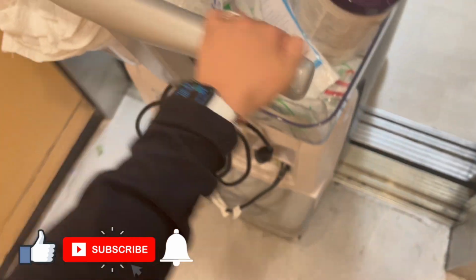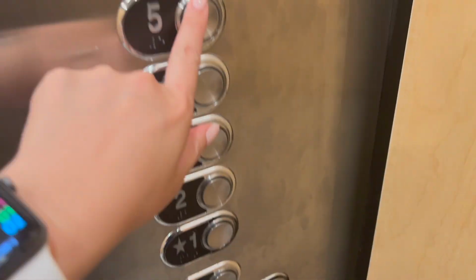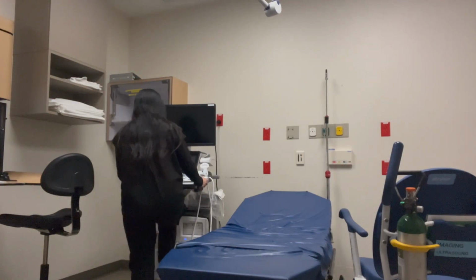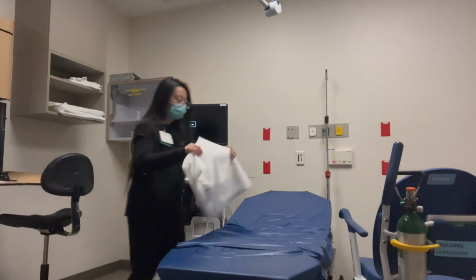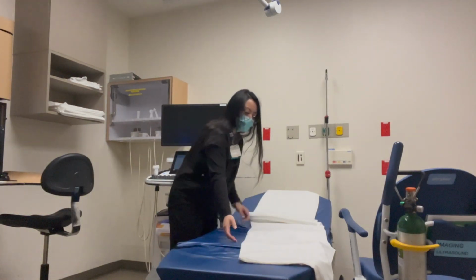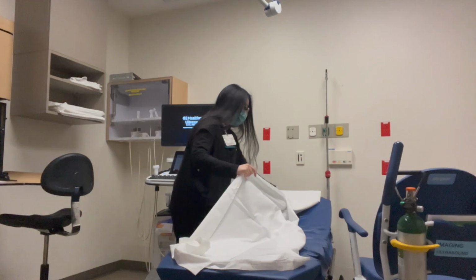Today I work a 10-hour shift, and because I work in a hospital, there are many different types of patients that need to be done. Inpatients are where the patients are admitted in the hospital and they're staying overnight. Outpatient is where the patient is coming in for an appointment. And an ER patient, or emergency room patient, is where the patient comes in through the emergency room and are here for a few hours, or they potentially become an admitted, aka inpatient, patient.